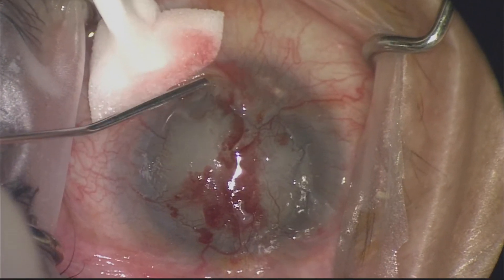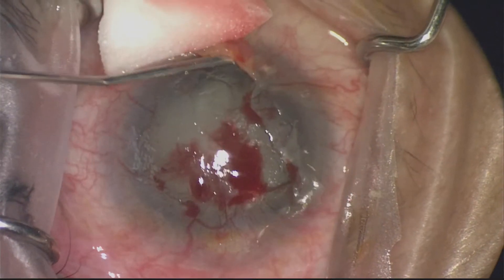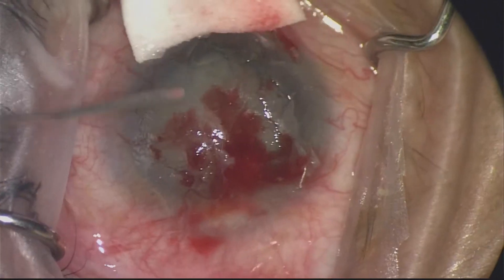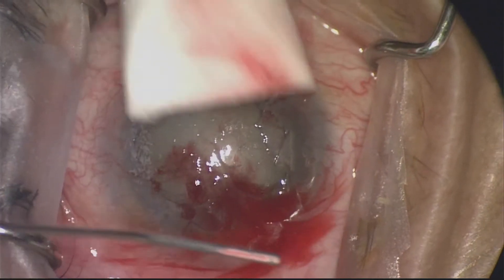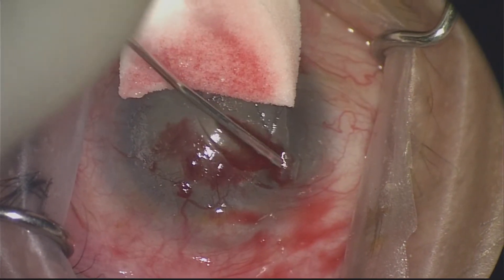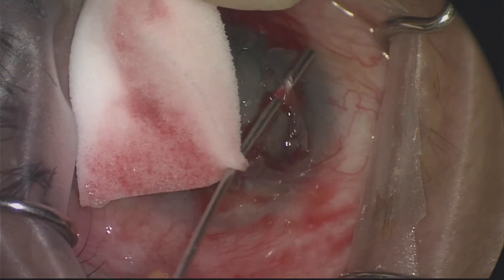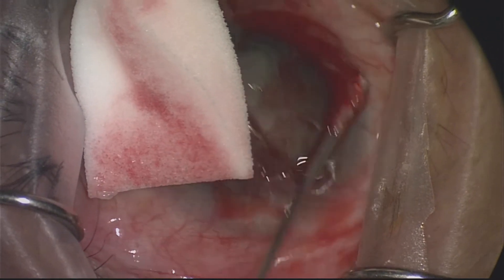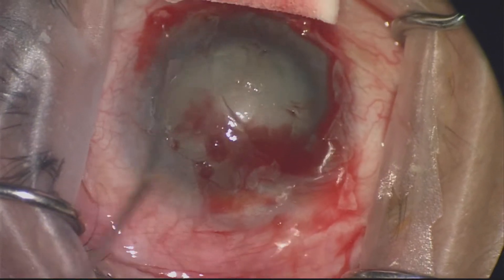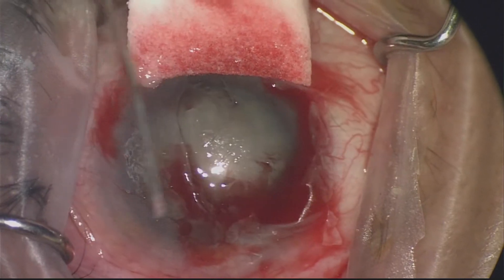As you can see so far, I don't use anything sharp on the surface of the eye. I use spears to take the epithelium off without too much trauma, and then I'm using a hydrodissection cannula to find a plane where I can lift up the superficial scarring on the corneal surface. Here I'm trying to pick away and find a plane — initially it looks like it won't be effective, but then you find a plane and you can see a bit more of the cornea.